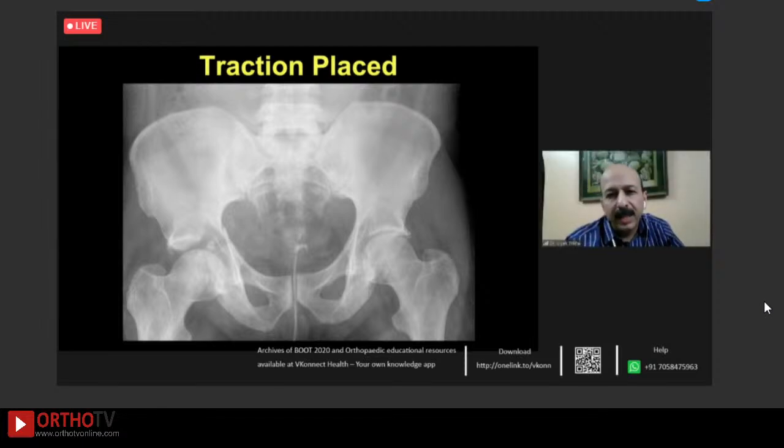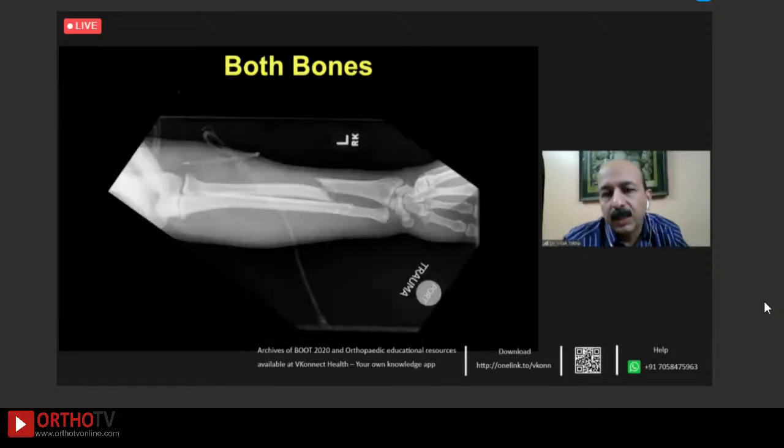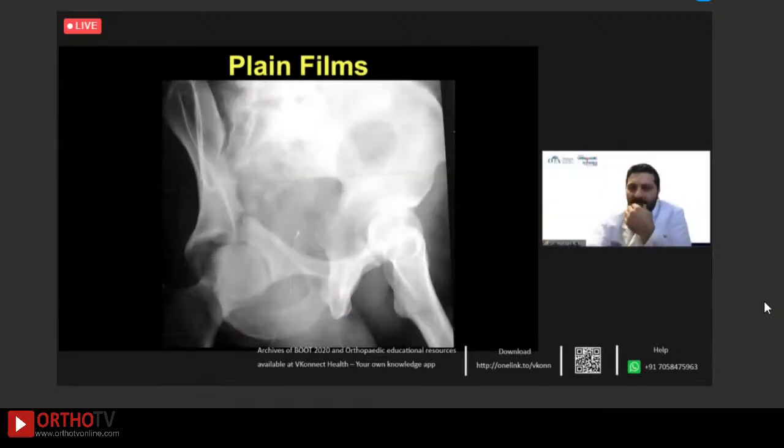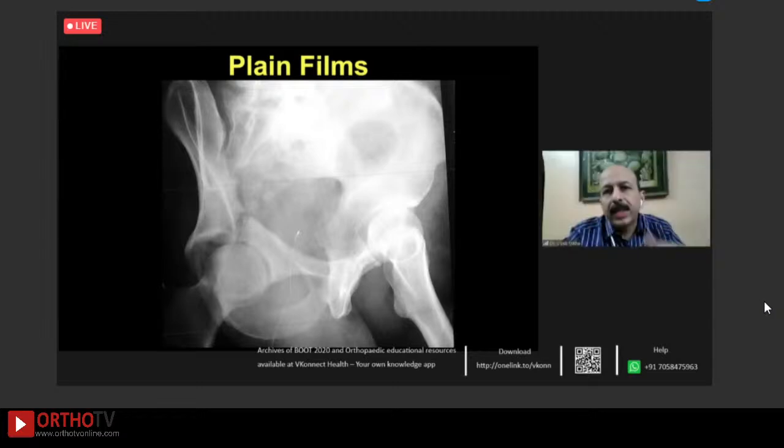Putting in this. So that is, I don't normally go anterior for transverse fractures. I normally go posterior because that's the common approach for a transverse. But for this fracture with a high column, both anterior and posterior, I tend to go anterior nowadays with an ASIS osteotomy combined with Smith-Petersen. It will help you address the sacroiliac joint as well. Yes, with a reduction as well as the screw fixation if required.